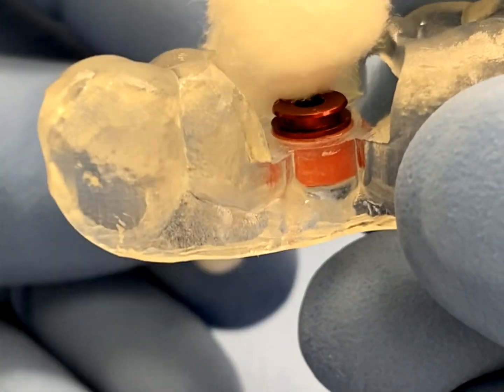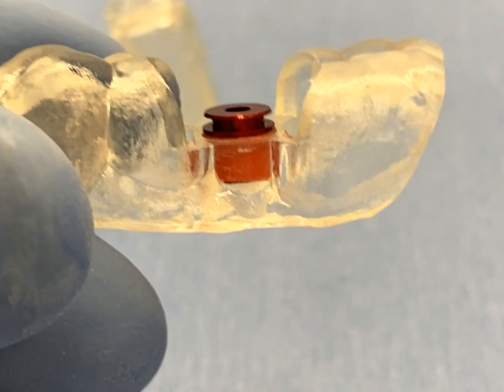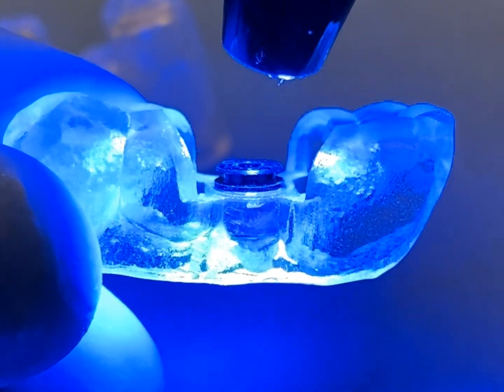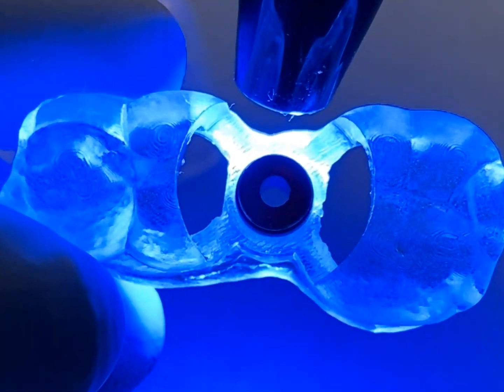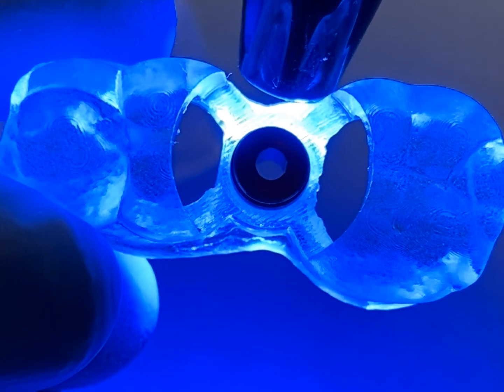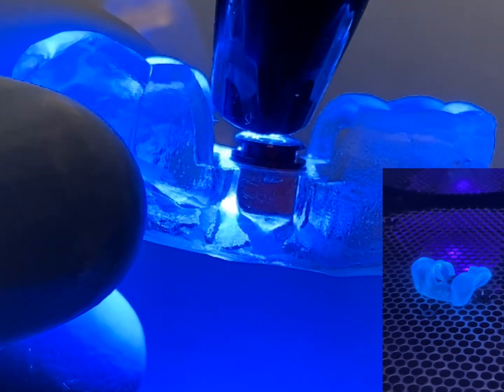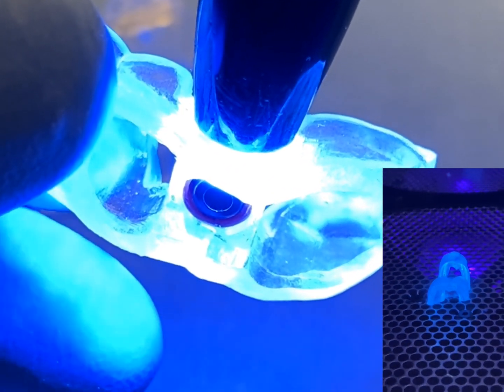If a dual cure adhesive is used, the complete set time for the adhesive will vary according to each manufacturer's specifications. If a light curable adhesive is used, simply light cure the adhesive by using a standard dental curing light or laboratory curing unit that uses light and heat to polymerize the adhesive used to bond the GRS surgical ring to the surgical guide.